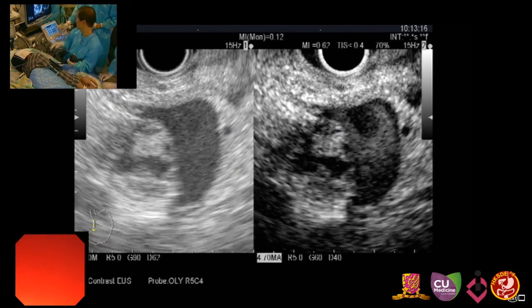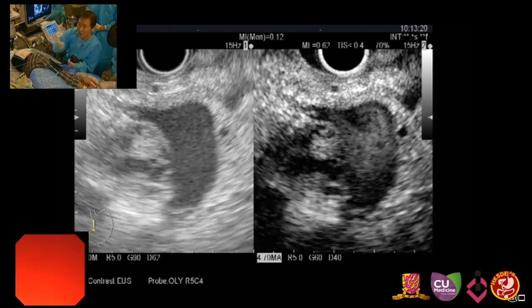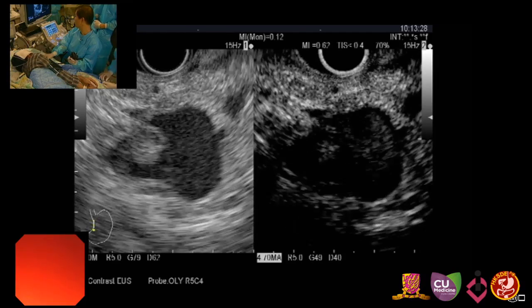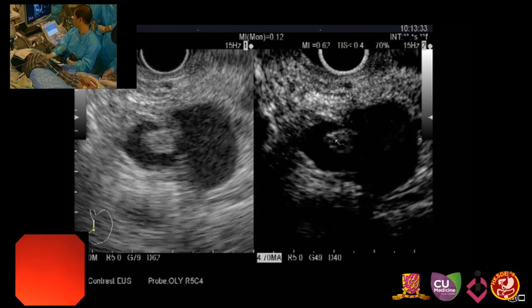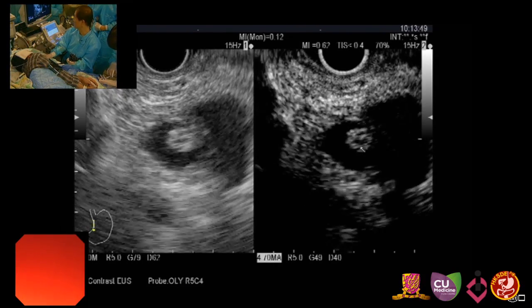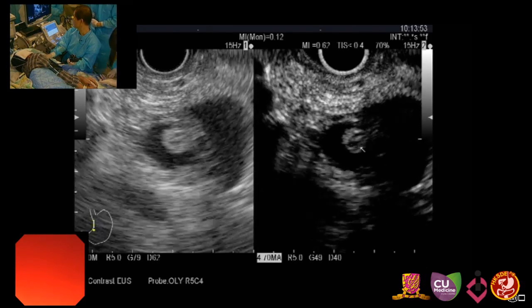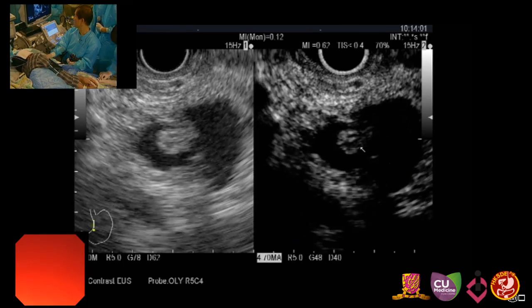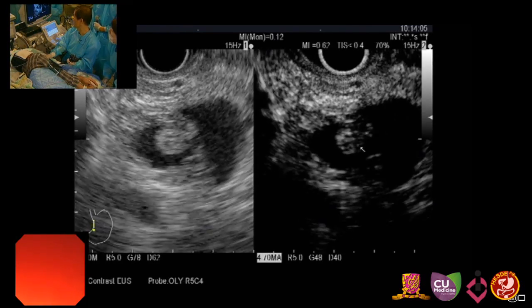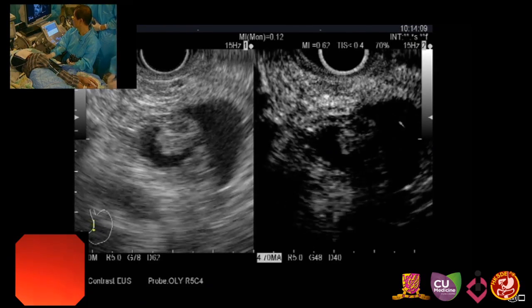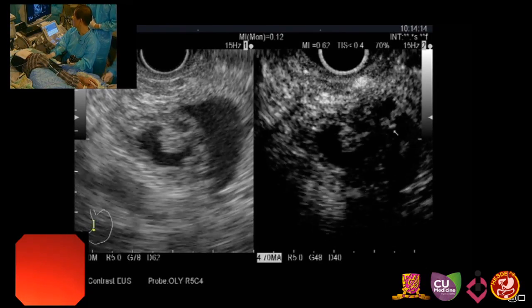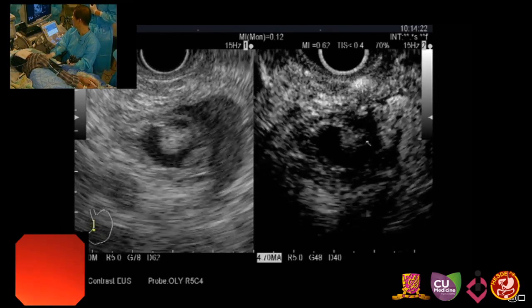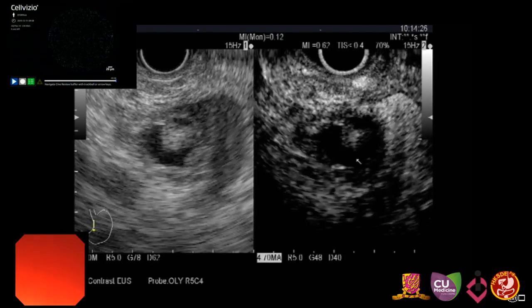Can we change to contrast mode? When you inject contrast, it takes about 10 seconds for vascularity and normal pancreatic parenchyma to show enhancement. We need to compare the pancreas parenchyma enhancement with the mural nodule enhancement. We are injecting SonoVue, a second-generation contrast agent, and we are looking at the harmonic imaging on the right side of the screen. Now the vessels start to show enhancement — there is vascular enhancement in the portal vein, and also we can see vascularity inside the mural nodule with moving echoes.